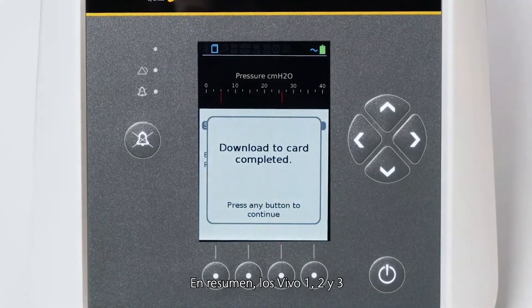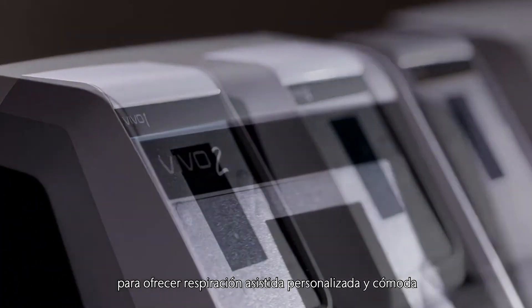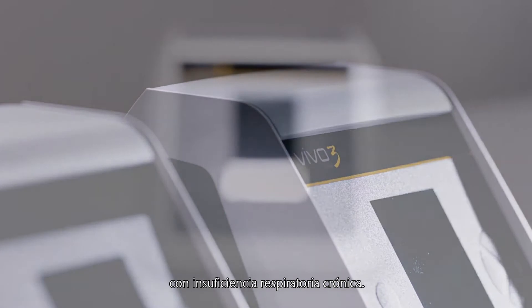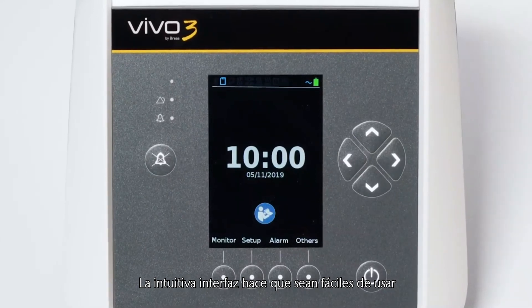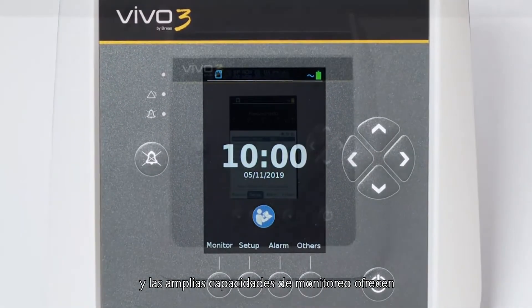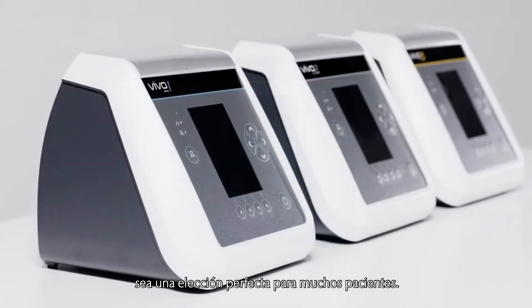In summary, the Vivo 1, 2 and 3 are a new generation of bi-level ventilators, designed for personalized and comfortable respiratory support for non-dependent patients with chronic breathing insufficiency. The intuitive interface ensures ease of use, while a comprehensive set of modes and extensive monitoring capabilities allow for great flexibility, making the ventilator a perfect choice for a variety of patients.